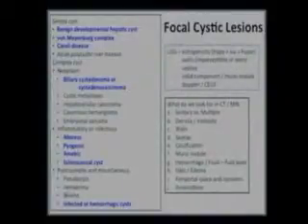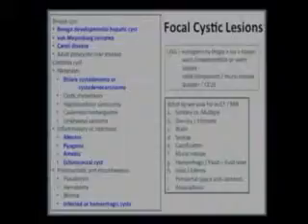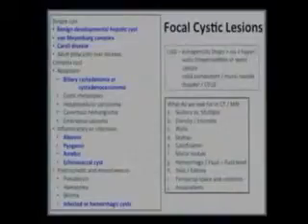Developmental hepatic cyst, the commonest of the lot. Caroli's disease has a direct extension of those. And then, of course, you have biliary cystadenomas, your infective pathologies, and some complicated cysts. This is what it comes to you as when a sonologist sends it to you, that he will tell you that you have a focal cystic lesion with or without a solid component, septations or calcification, and you need to evaluate this, whether this is benign, this is questionable, where you need to aspirate or put in a needle, or you just leave it as it is.